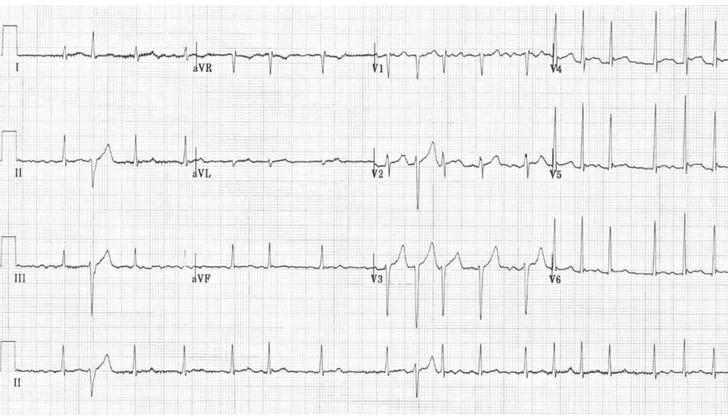Okay, so the Ashman phenomenon wasn't a misinterpretation. It was actually there. Yeah. And it kind of tipped them off to the atrial fibrillation. Exactly. It's like a little clue on the EKG saying, hey, there might be something else going on here, something you need to look into. A little EKG whisper. So we've talked about how it looks on the EKG and how it can be a sign of AFib.